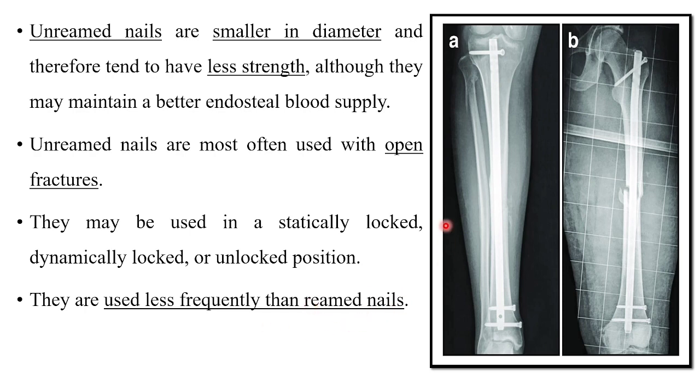So this is a statically locked tibial nail to stabilize mid-diaphyseal fractures. And second, this is a statically locked femoral nail. This is a femoral nail to stabilize mid-diaphyseal short oblique fractures.